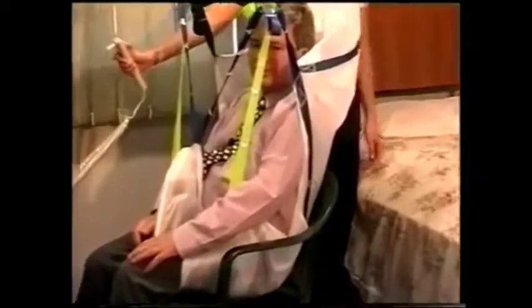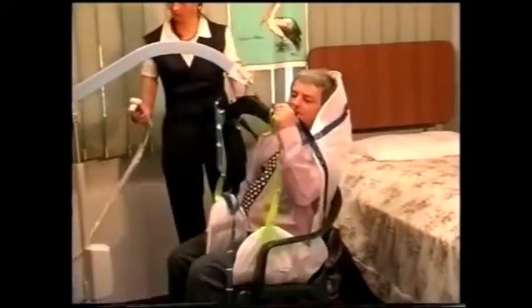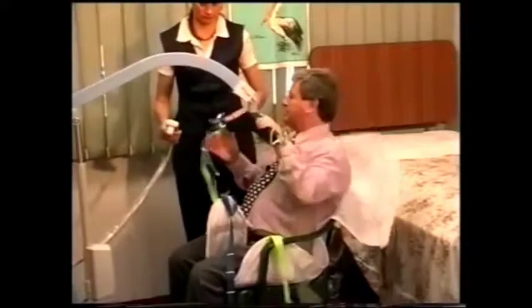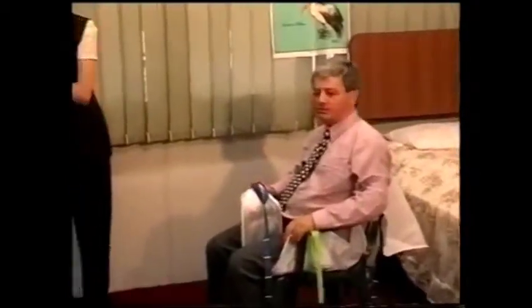Can you go down on my bottom, come in close, James? Yes, I've gone straight down into the chair. Fine. And just watch the head as it comes down. Get it down. First thing, get all the straps off as quickly as you can. And then get the hoist out of the way. Another reason for having the brakes off on the hoist. You can get it clear. The patient isn't going to rock forward and hurt themselves.